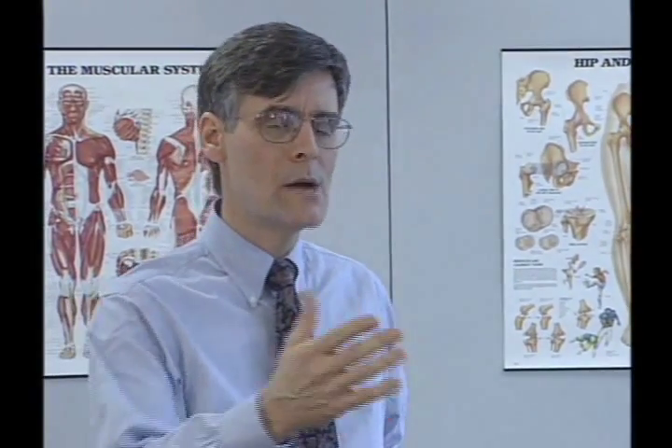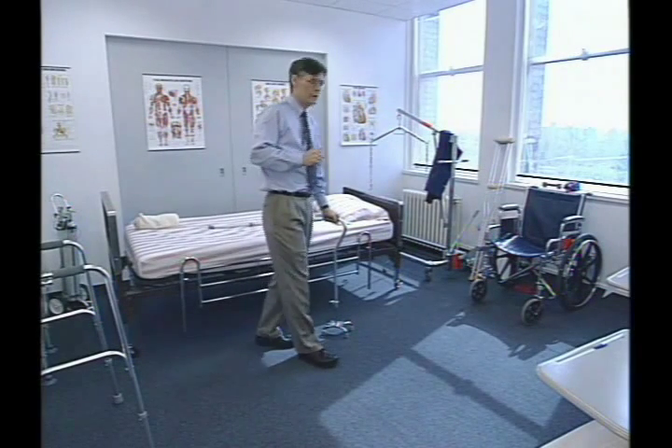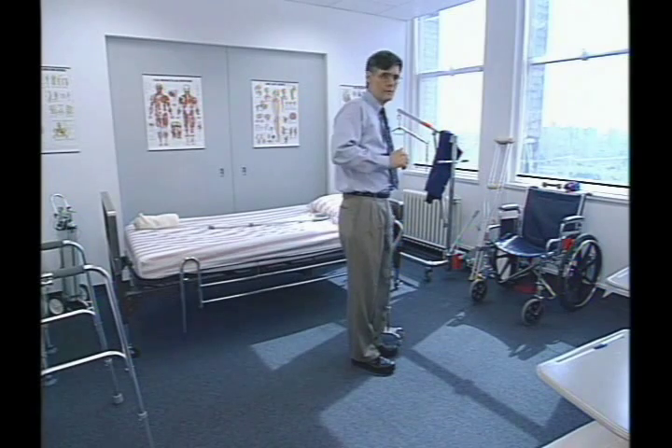The technique for using the quad cane is identical to using the walker — it's a stop-and-go technique. So we place the cane, the foot, the other foot. The cane, the foot, the other foot.